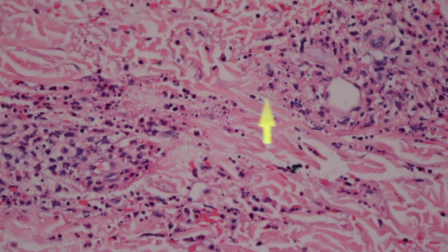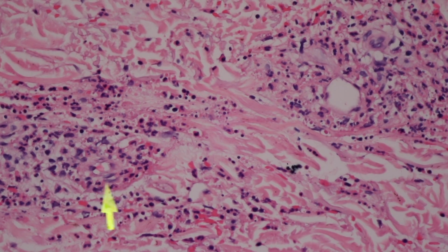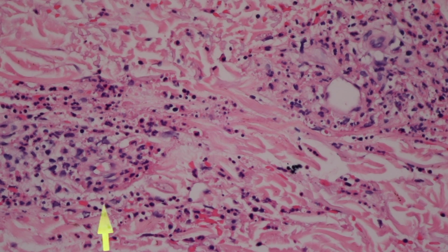Now, sometimes you have more or less of these features. Sometimes you'll have neutrophils around vessels, but you won't really have debris or fibrin. In that setting, you have to be a little careful to not overcall something as leukocytoclastic vasculitis, because anytime you have neutrophils coming into the skin, whether to fight an infection, whether because they're coming to the surface to attack yeast or fungal hyphae that are growing there, whether they're coming in for a folliculitis, whatever the reason, remember that neutrophils come from the blood and they have to get out of the vessels and into the skin through diapedesis, the white cells crossing over the vessel wall. And in that process, you're going to see a lot of neutrophils clustered in the vessels and coming out of the vessels.